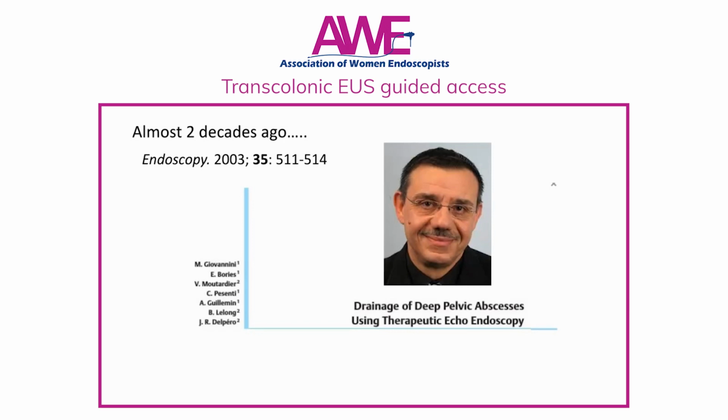And what Mark showed has revolutionized interventional EUS, in the sense that if you can localize the area to be punctured, and you're able to put in catheters and plastic stents, we're able to drain these abscesses and improve the outcome of the patient, which is more cost effective, and this can even be performed at the bedside in critically ill patients.